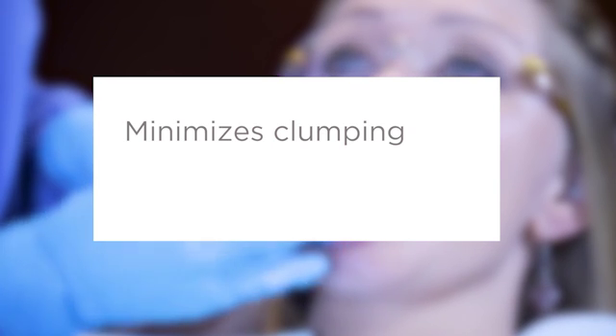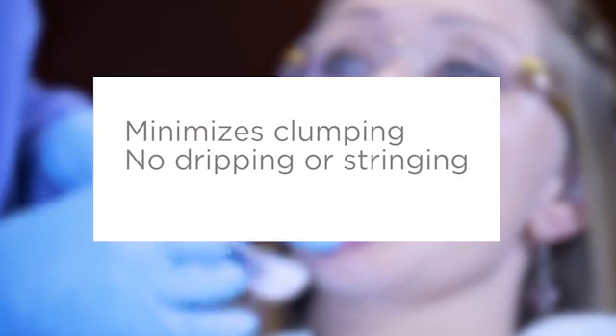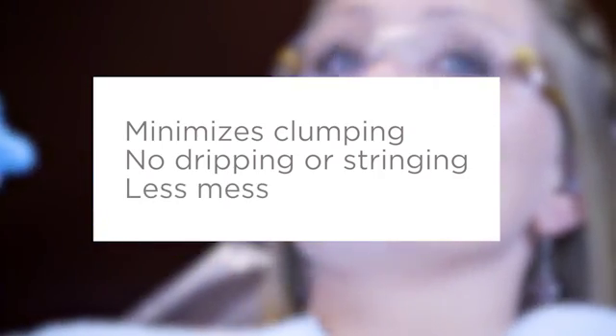90% of hygienists reported no clumping when the applicator contacted saliva. And Nupro White Varnish is uniquely formulated not to drip or string, so you can apply it with less potential mess.